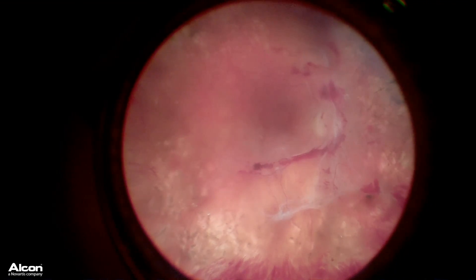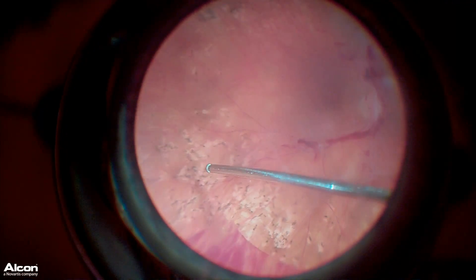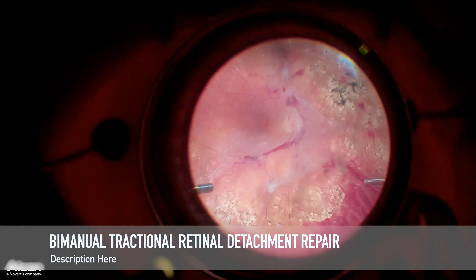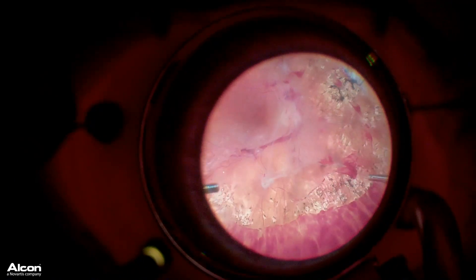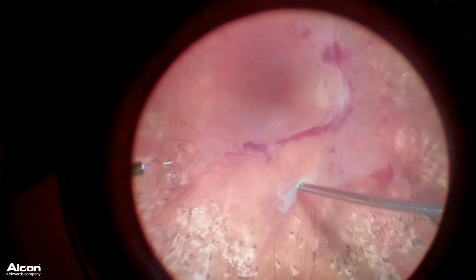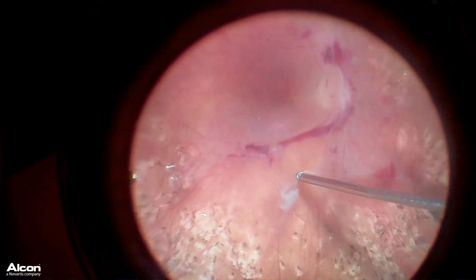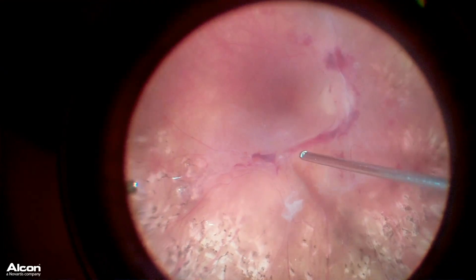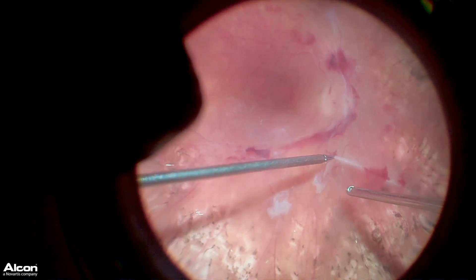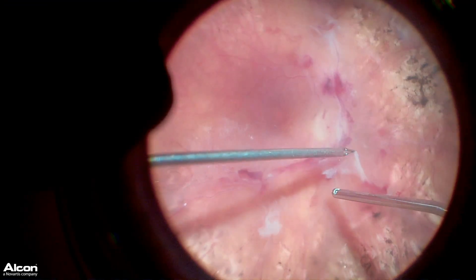This is a case of a severe diabetic tractional retinal detachment and vitreous hemorrhage from proliferative diabetic retinopathy. These are some of the more challenging cases that we encounter because the scar tissue can be just so adherent to the surface of the retina. One of the things I've found very valuable that not many people talk about is the use of bimanual surgery.